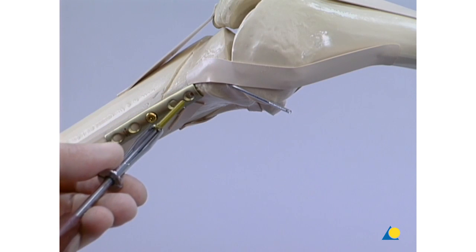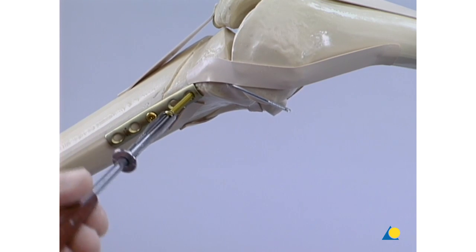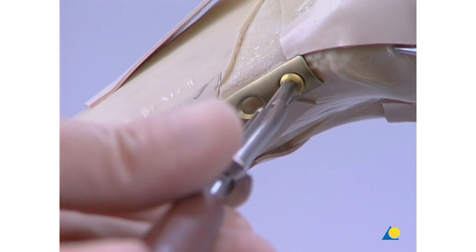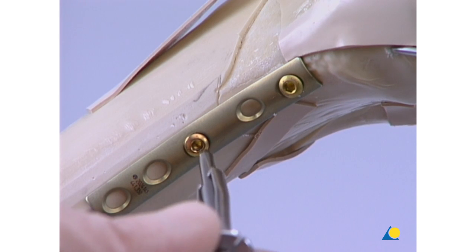Next, a cortex screw is introduced through the most proximal plate hole. After placing the most proximal screw, the first screw will need to be re-tightened.